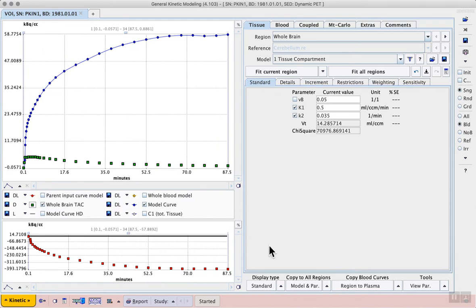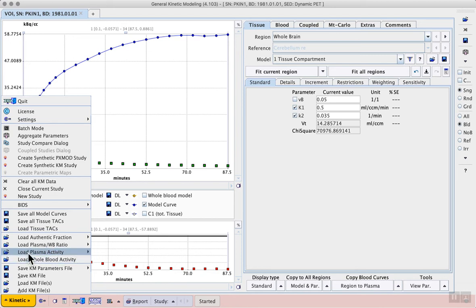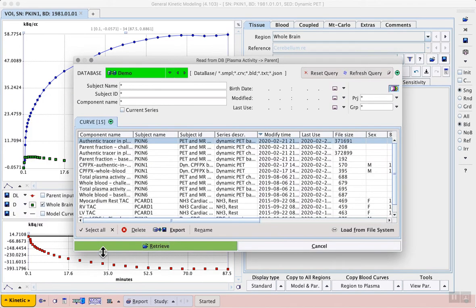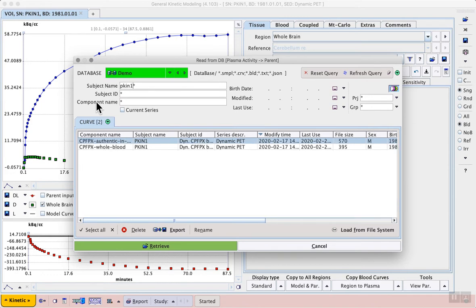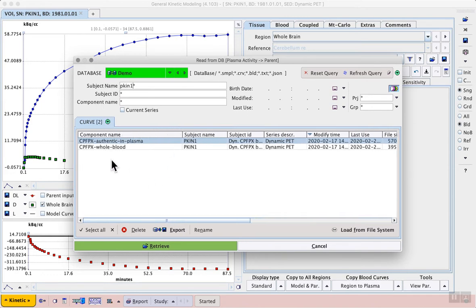Next we need to either have a ratio to convert that into plasma concentration or a file that already contains the authentic plasma concentration. In this case we have a corresponding curve with the authentic concentration of tracer in the plasma, so we can use load plasma activity.